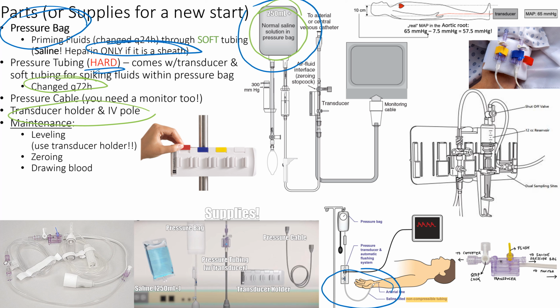We need a transducer holder. So it's nothing fancy, it's just a little holder like this. All right, we have plenty of these. We overbought them. So these are the transducer cables. We have to grab the little markers that tell you that's red, yellow, or red. But either way, this will work for you.